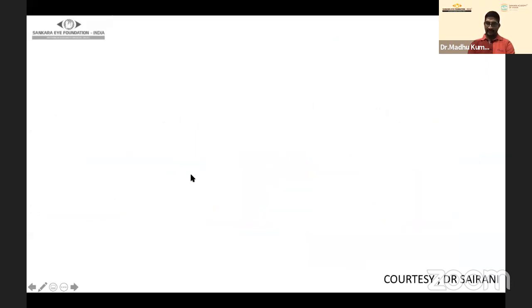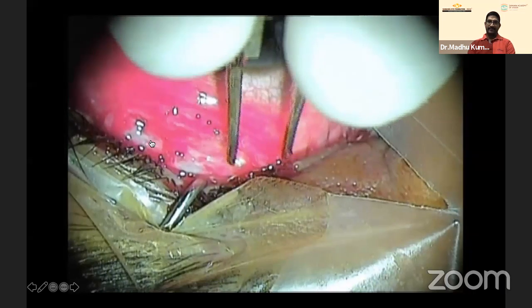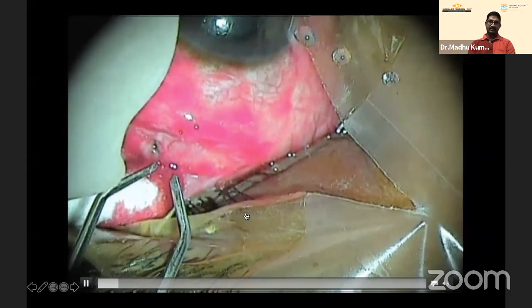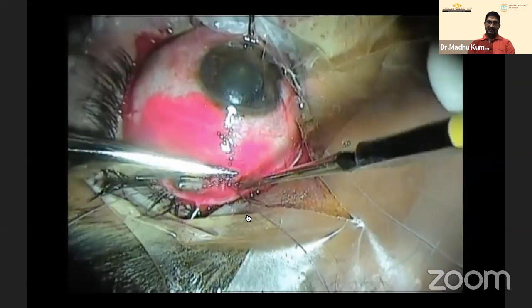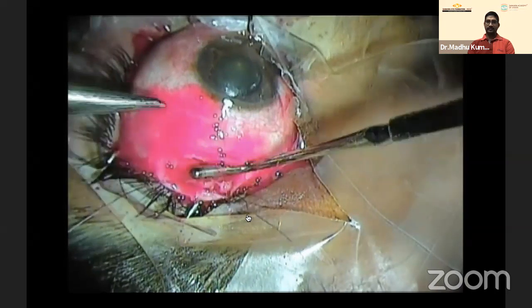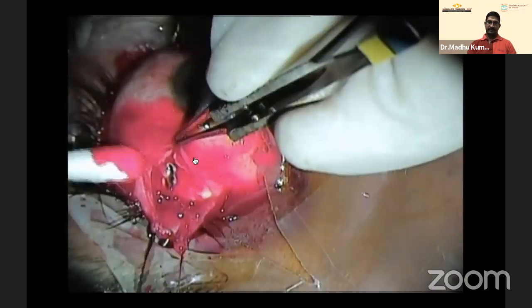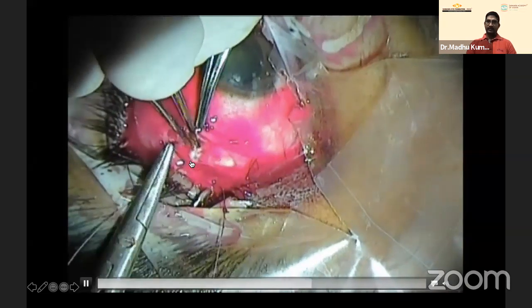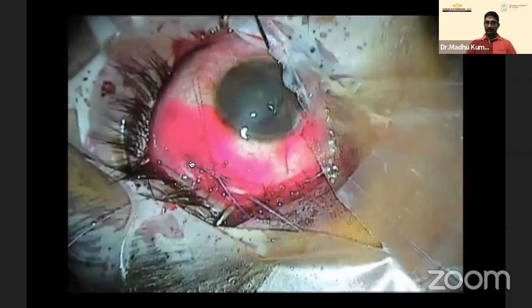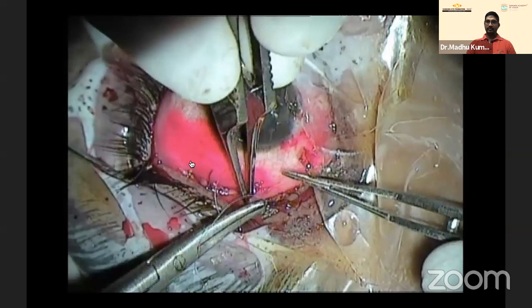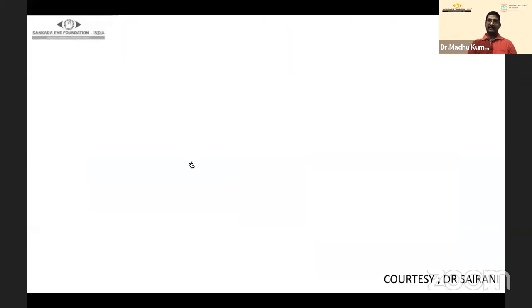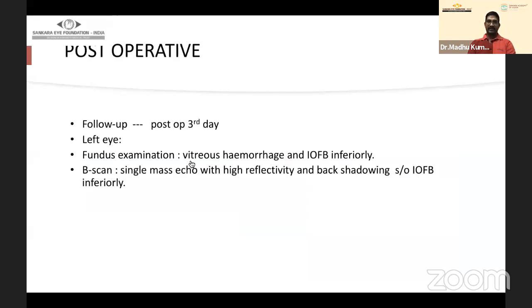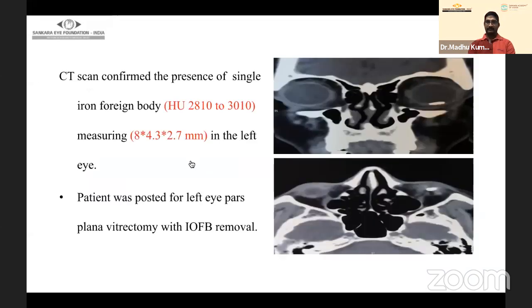The scleral tear was repaired. Timely repair is essential — leaving it open allows infection and scarring that leads to devastating complications like PVR. On follow-up post-op day three, a foreign body was confirmed by CT scan: a single foreign body measuring 8×4.3×2.7 mm in the left eye. The patient was posted for left eye pars plana vitrectomy after one week.